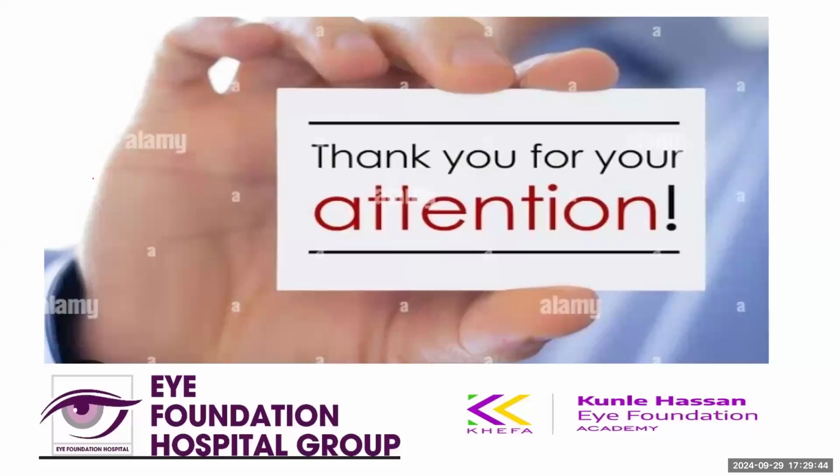So that's where the importance is. The vessels within the disc are also of importance in glaucoma. There are studies on it, and we could check and read them up, but the peripapillary seems to be the more studied type. That's why I chose that in this presentation, and I've also done a little study on that.